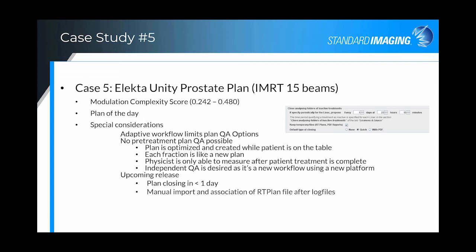And so in this upcoming release that should be out shortly, we have the plan closing in less than a day, and manual import and association of the RT plan after the log files have been picked up by LinacView, just to support the case when the RT plan may not have been exported, or someone has forgotten to export the RT plan before the actual delivery occurred.